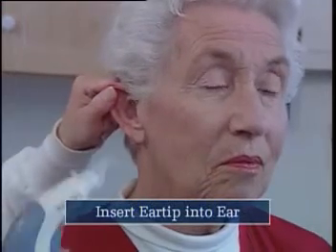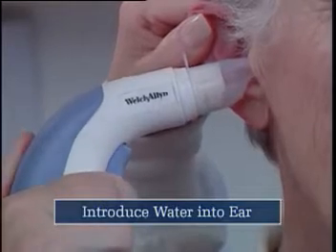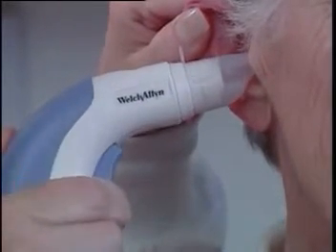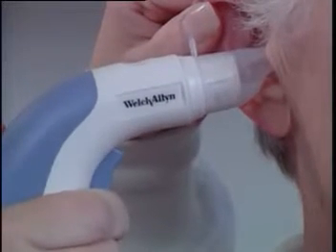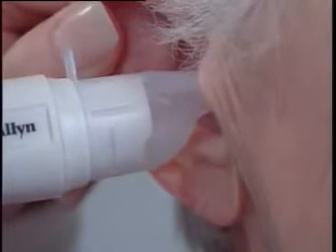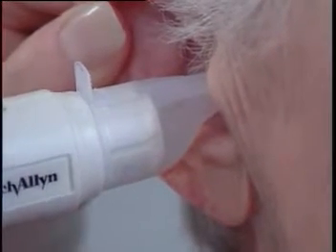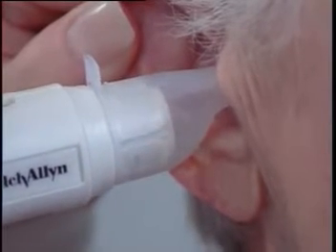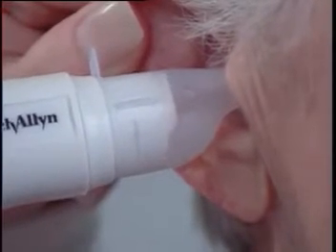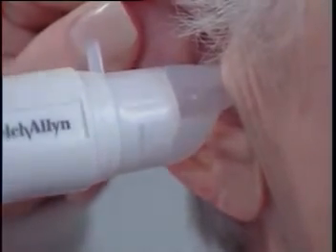While maintaining tension on the pinna, insert the tip of the handle into the ear to create a seal. Squeeze the actuator on the handle to release the stream of water, using finger pressure to attain some control of the flow rate. It is important to aim the stream of water toward the ear canal walls by tilting and slowly rotating the handle during irrigation to avoid the risk of perforating the tympanic membrane with direct contact by the stream. Flood the canal with water, allowing the hydrovac action to return the discharge away from the ear.